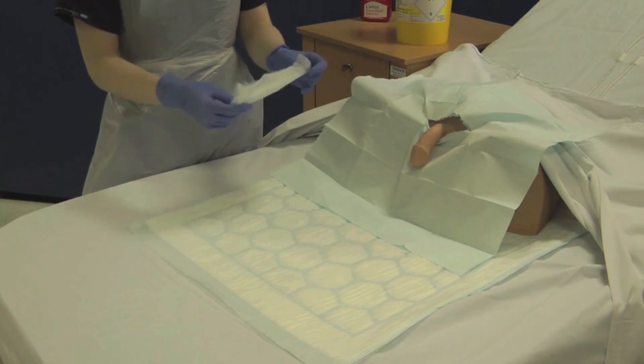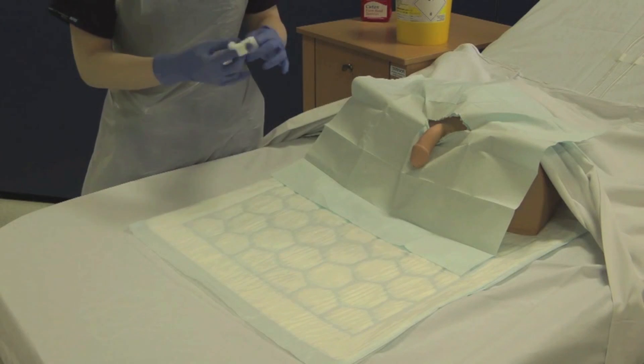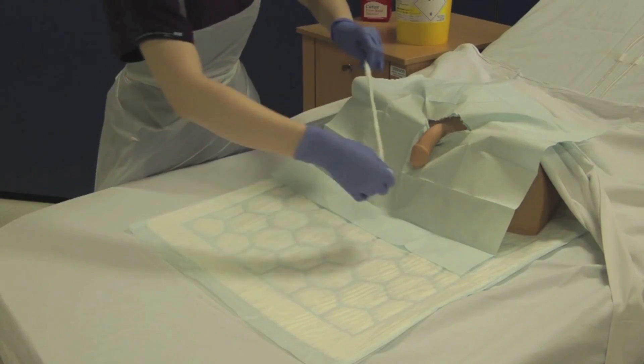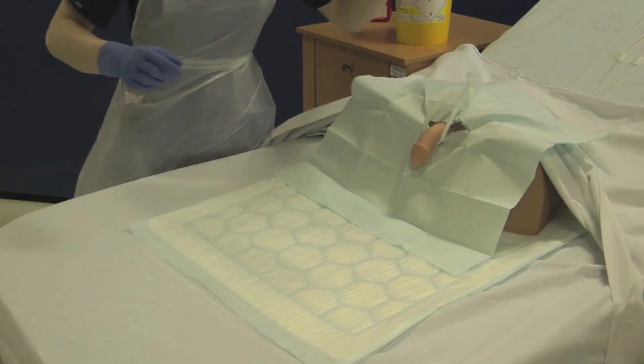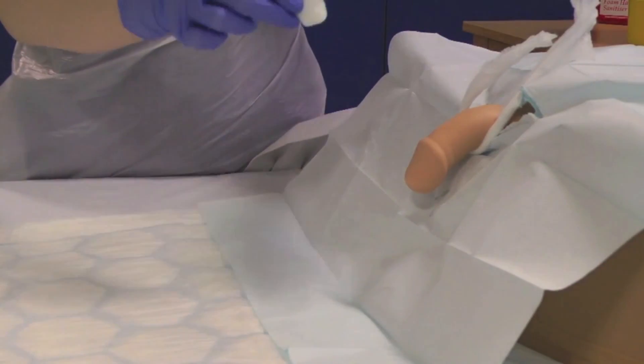Use a sterile gauze to create a sling. If necessary, retract the foreskin and use a minimum of five cotton wool balls to clean the glans penis and the penile shaft from tip to base.